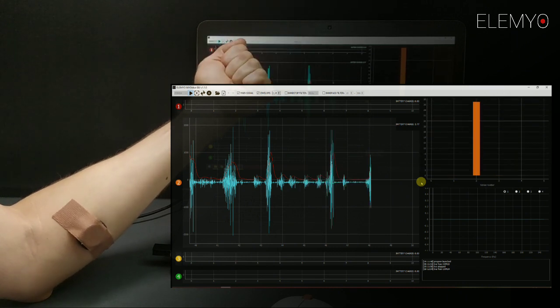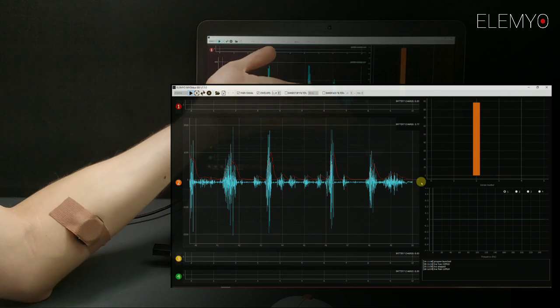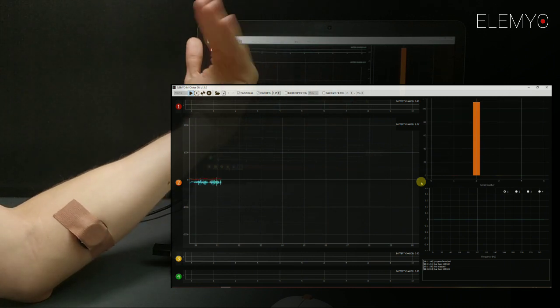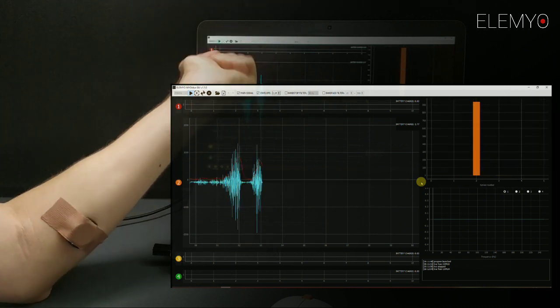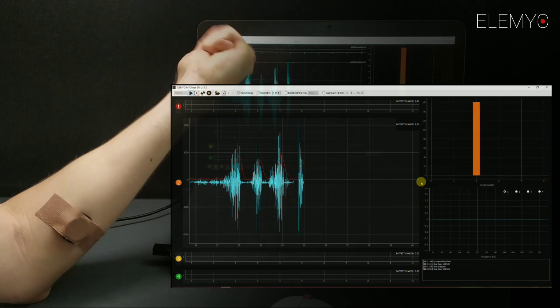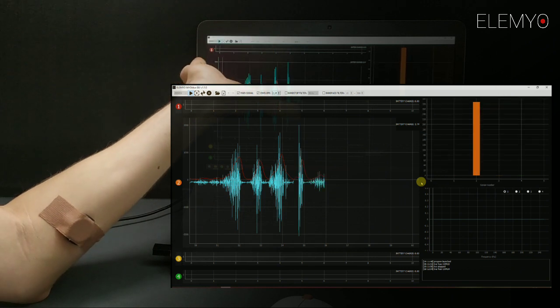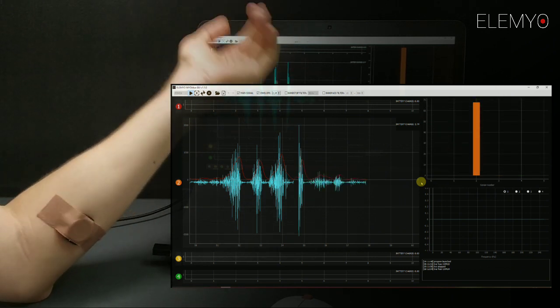Please make sure that you don't have any physical contact with the laptop. This can cause a 50 Hz noise in the signal, due to which muscle activity visualization will not be as clear as it could be.